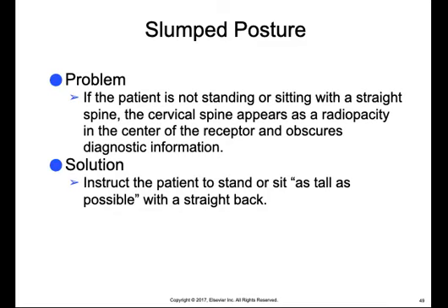That's not something that we want to see in an image. To prevent this, we instruct the patient to stand or sit as tall as possible with a straight back. We always want patients standing for a panoramic image, but if they can't stand, like they're in a wheelchair, we want them to sit as tall as possible with a straight back.